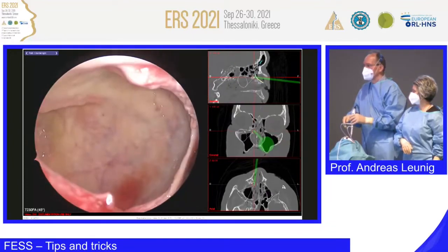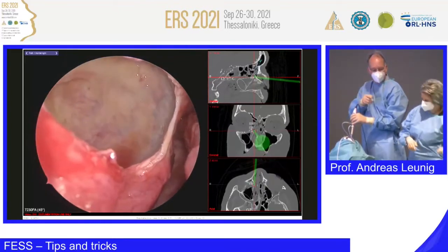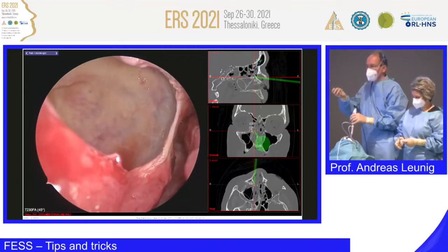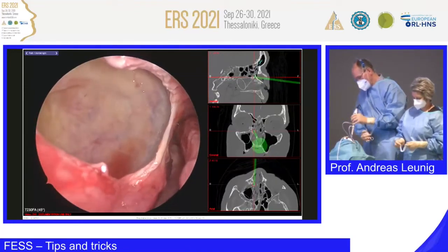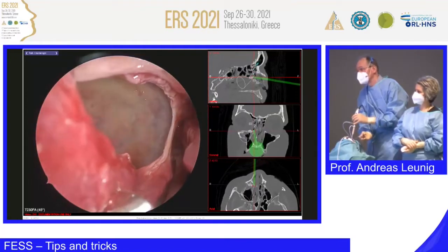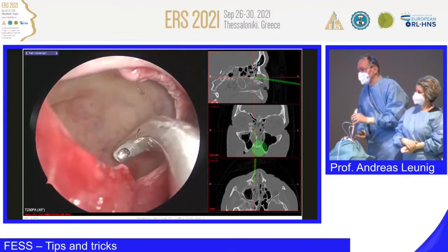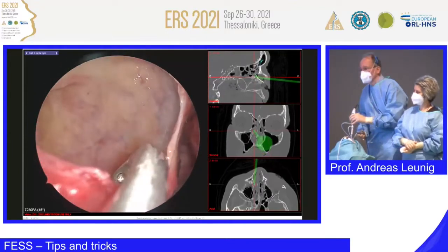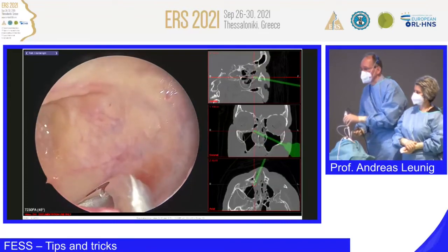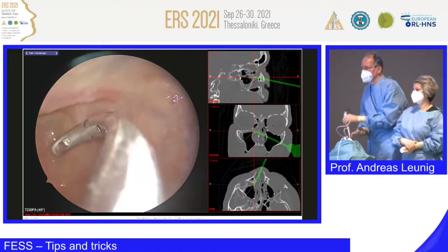And how can you now deal with pathologies in this area? The Heuwiese, please. There's a very nice instrument. It's called Heuwiese. The only thing is you have to bring this Heuwiese in the right way into the maxillary sinus, and I rotate it in like this. Please don't injure the mucosa. Try to make it very gently, very soft. And then you can go here inferiorly, you can grab some pathology wherever it is.